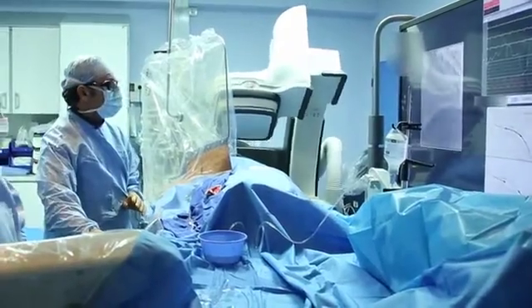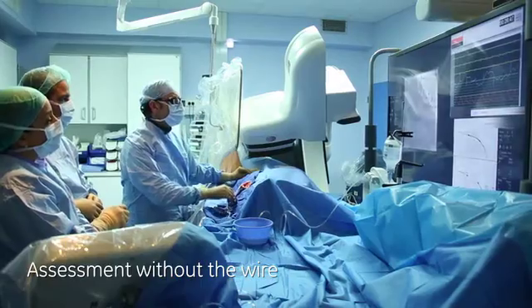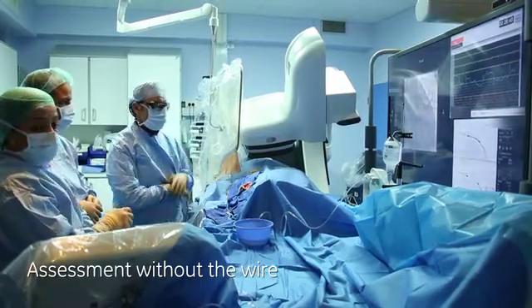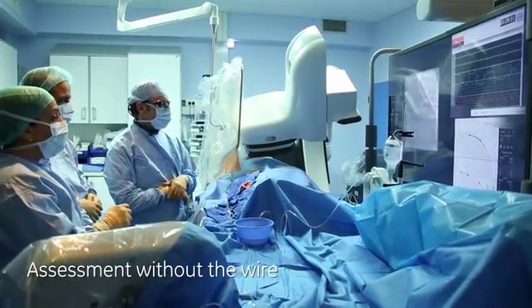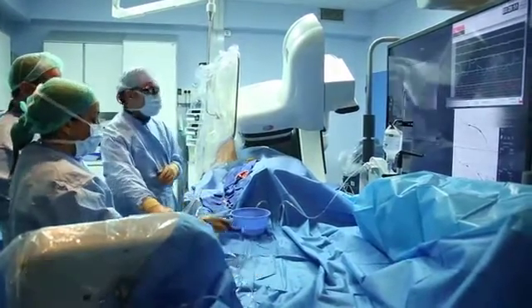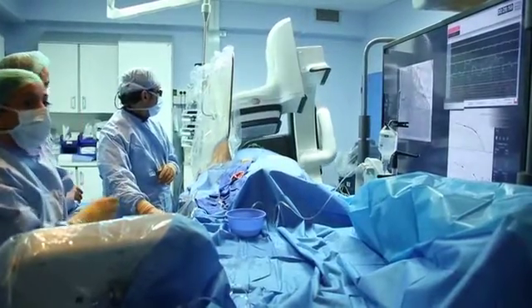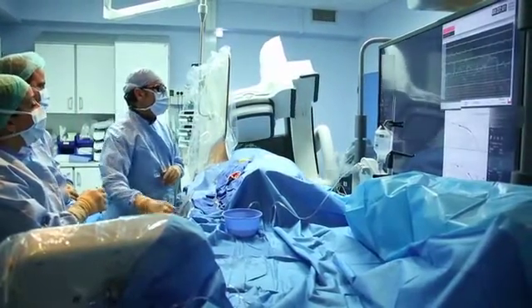Let's check with another view, maybe a caudal view. Remove the wire. Very good result. Cranial view without the wire inside.